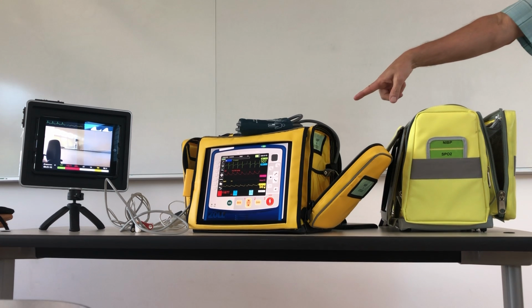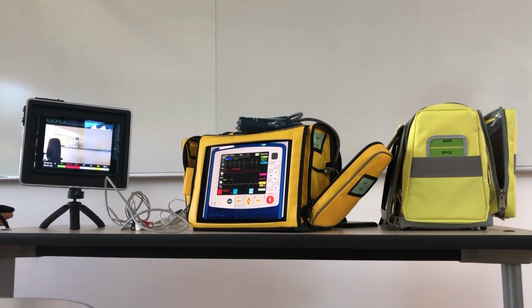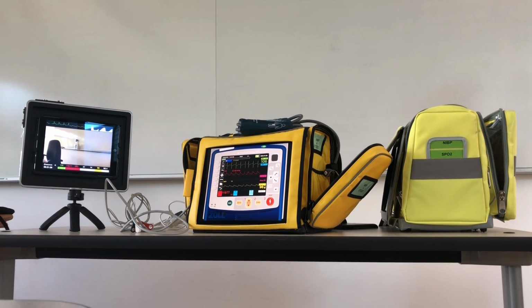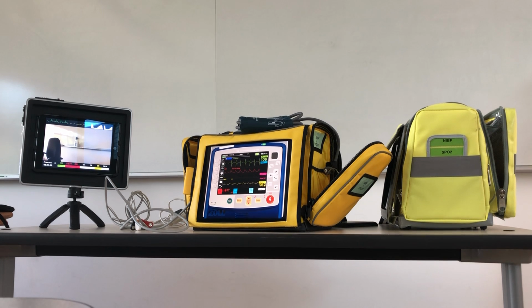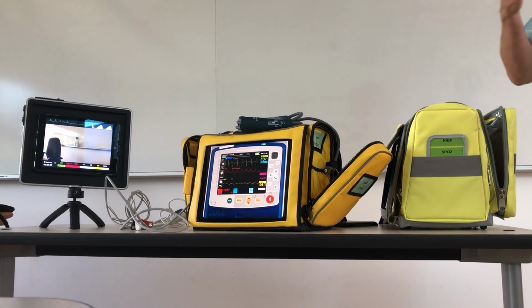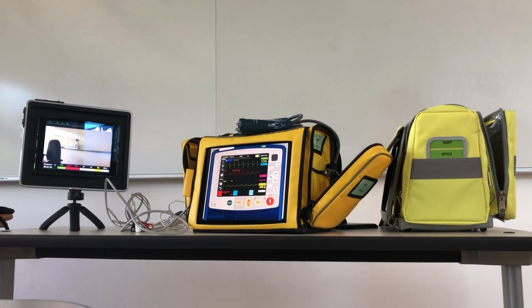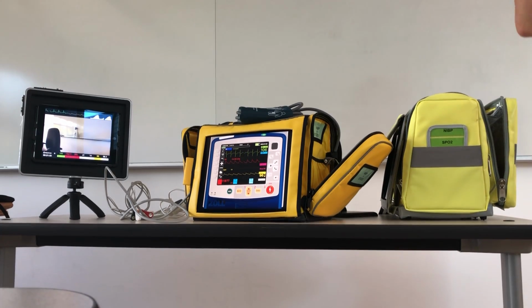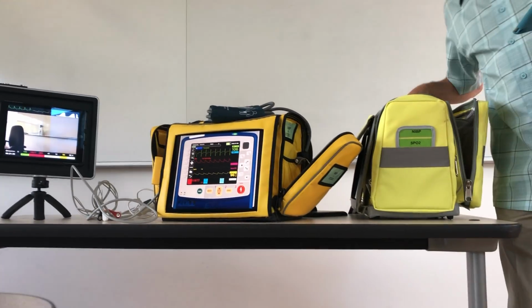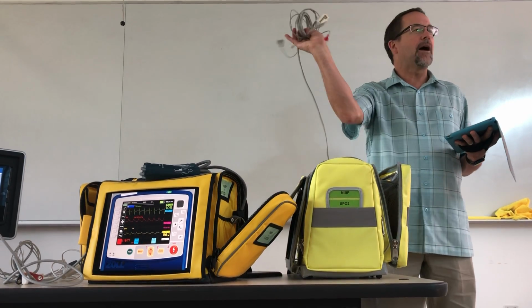In our first generation, because what they sent me was a 3-lead, I scavenged old LifePak 12 cables, since at that time that's what everybody was using in our area, and I just put a set of those in there. But you absolutely could do that, pull a set of those old cables, especially if you've got any extras, put one in every kit, and that way it's totally familiar, because the cables that they send with them don't look like either a Zoll or a LifePak cable.